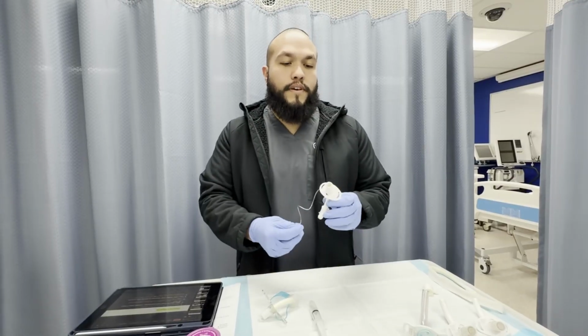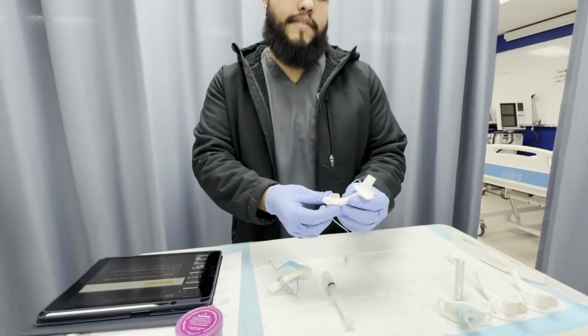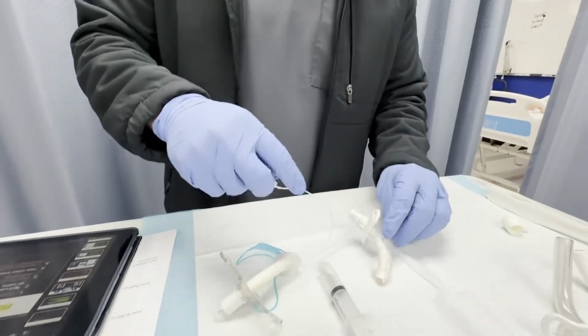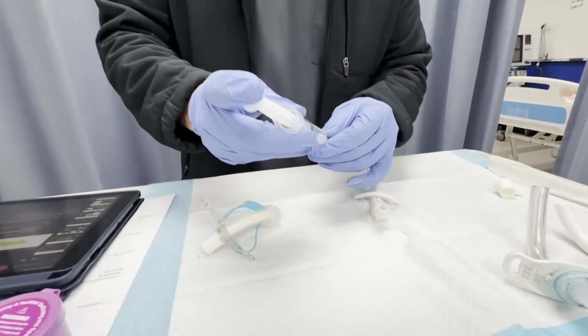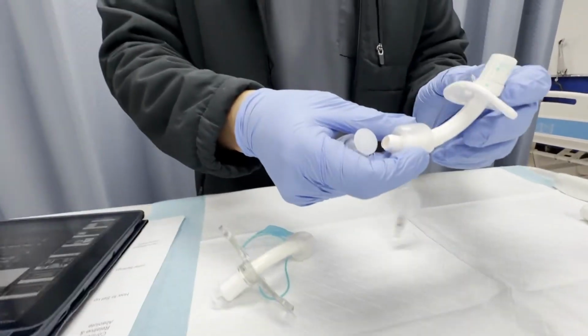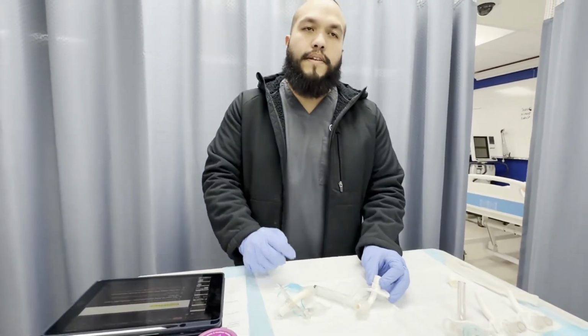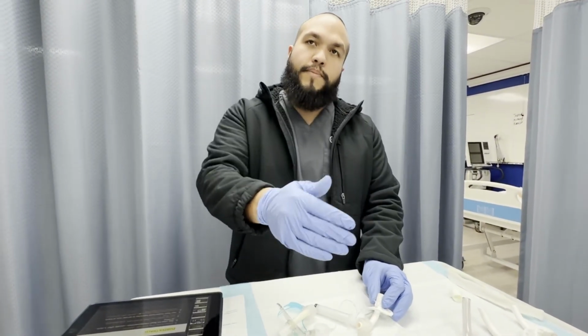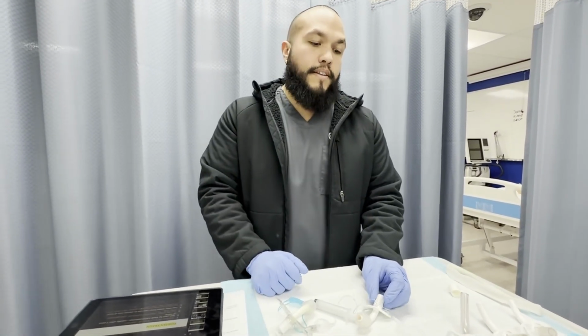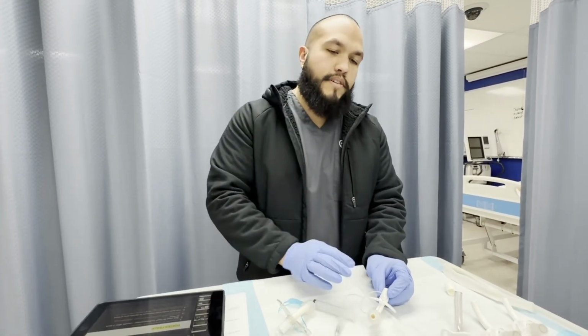Okay, so here we also have another Shiley trach, right? The difference is that this one is cuffed. It has a little balloon at the end, so you would inflate it like so. See how it inflates there, like a little balloon. The purpose of the cuff is to seal off the airway, so you can administer the mechanical ventilation, and it doesn't allow any aspiration. Nothing can come down, no type of secretions go down into the airway.